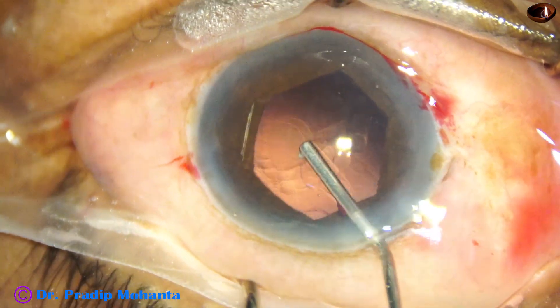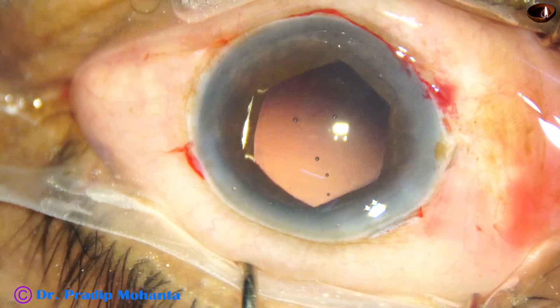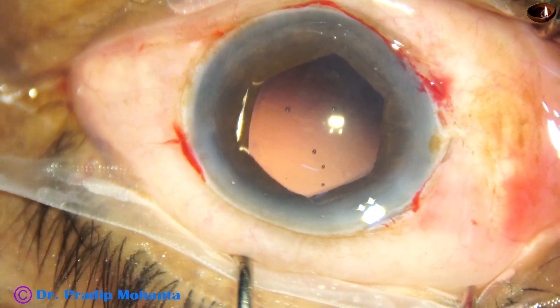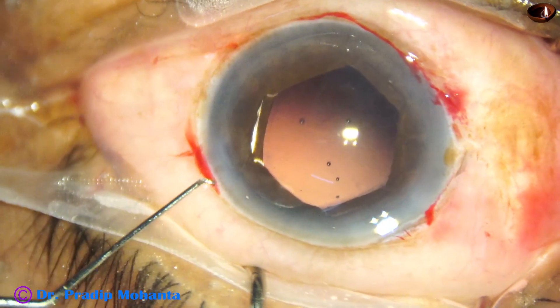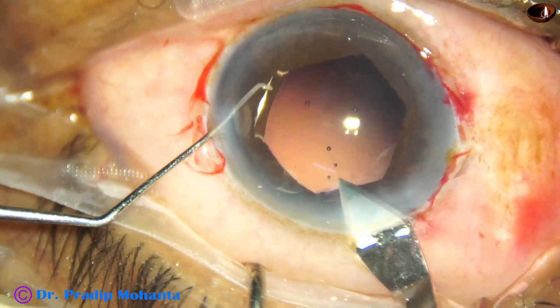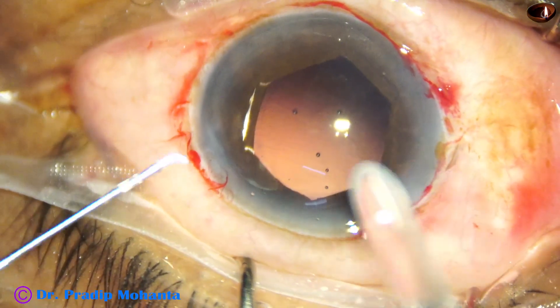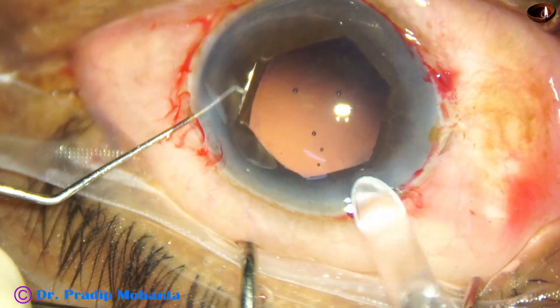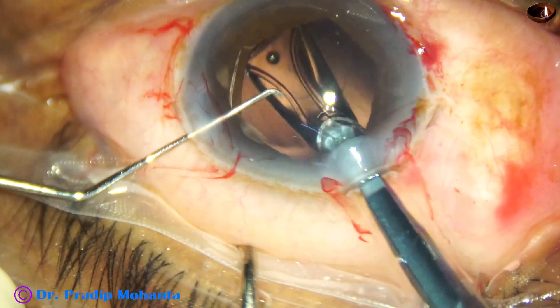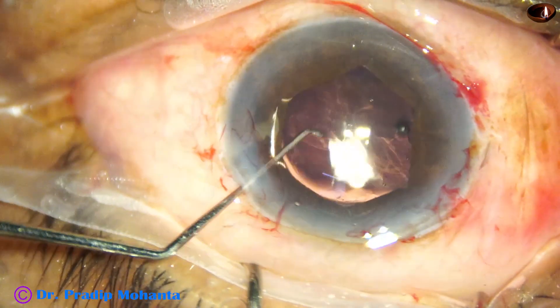Injecting visco. I am going to use a B cartridge. The main wound is being enlarged a bit — the wound which was 2.8 millimeters is now about 3 to 3.1 millimeters — and here goes the intraocular lens. The lens goes into the capsular bag.